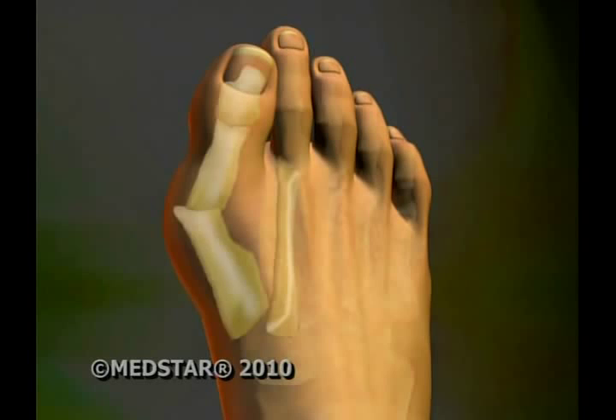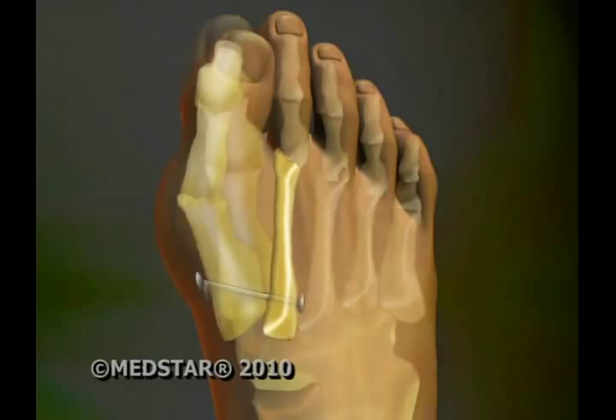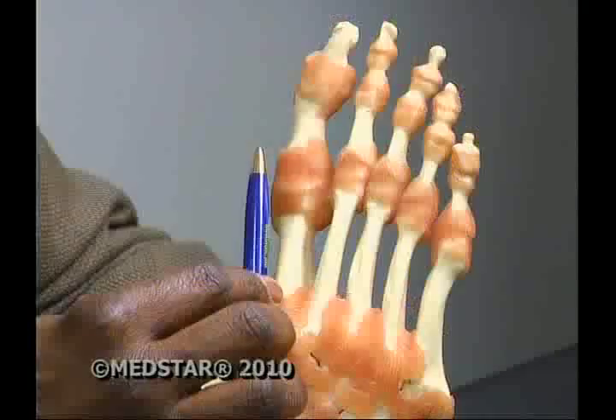For the mini tightrope procedure, small holes are drilled in the first and second toe bones, and a cable is secured on either side. We link a fiber wire suture, which is almost like a wire, but it's flexible. It's like winching up a tower piece and making it straight again.